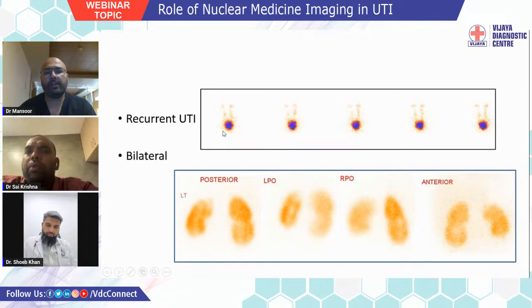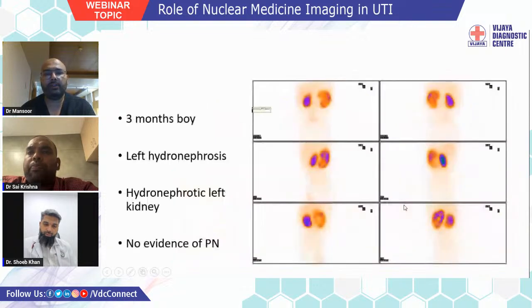And in recurrent UTI with bilateral reflux, you can see that there is central photopenia in both kidneys, suggesting hydronephrosis. And you can see peripheral defects. If the defect is peripheral, we call it a pyelonephritic focus. If it is central, it's more likely due to hydronephrosis. And then you can see that the renal contour is affected on both sides. There's an interpolar cortical defect here, and a lower pole defect. So this is the right kidney, and it is relatively enlarged compared to the left kidney. This is a case of bilateral pyelonephritis.